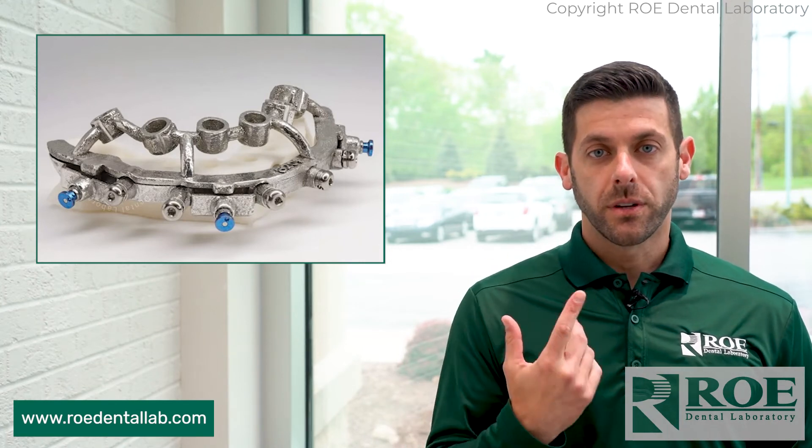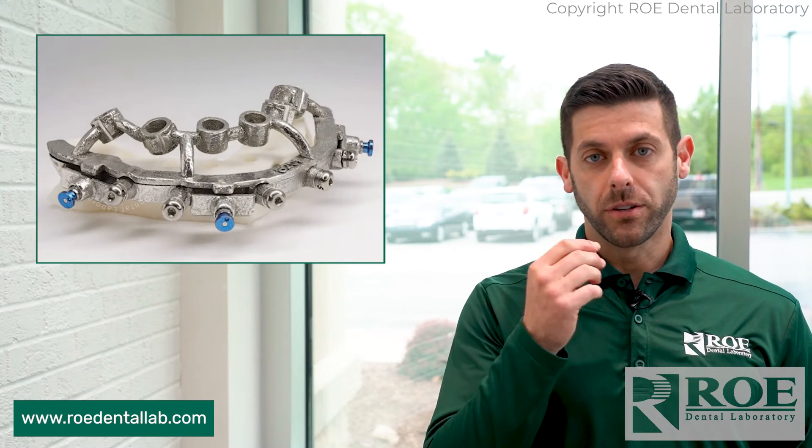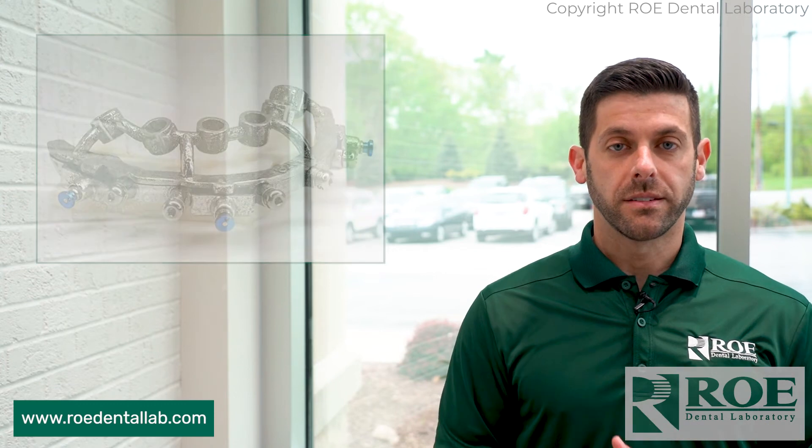Seat the osteotomy guide, drill your osteotomy sites, place your implants, and then you're off and running. Remove the guide and you're good to go. Suture the patient and send them on their way.